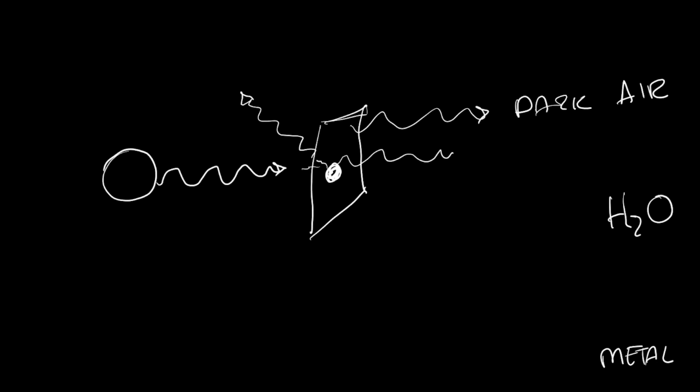One of those structures is typically minerals. The one that we're going to talk about today is calcium, right? And things that were less dense than water, but not as hypodense as air, which was going to be fat.